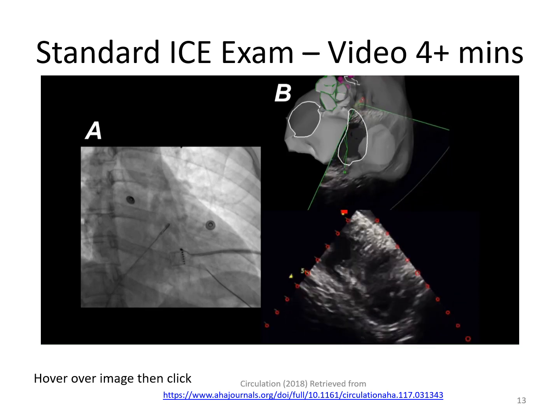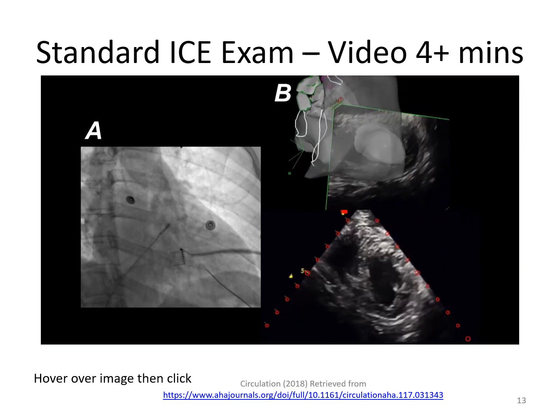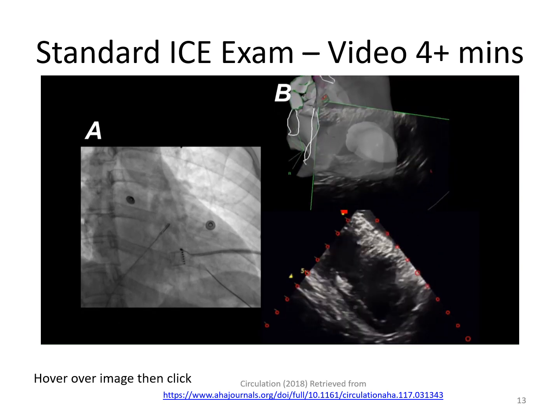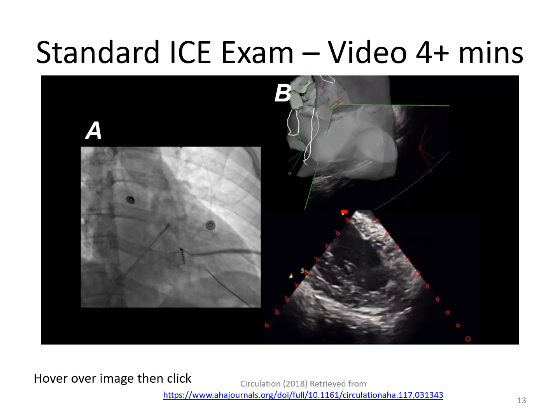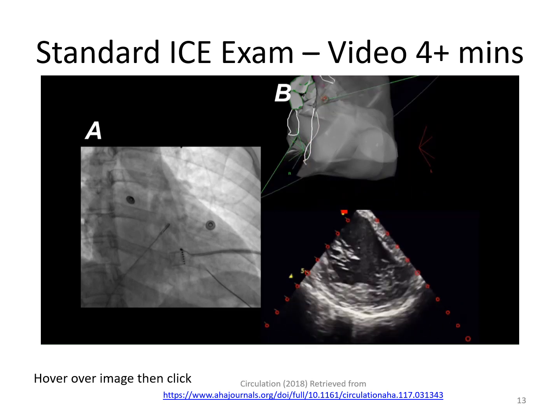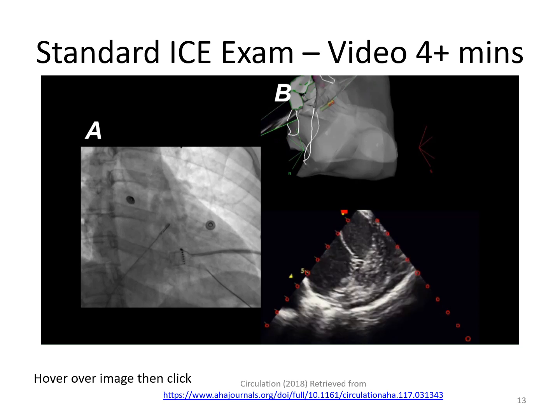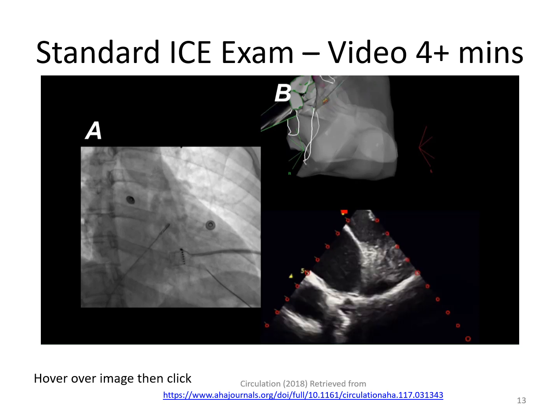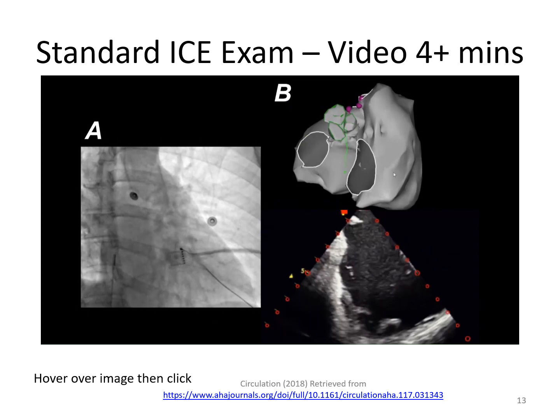tract. From this position, we can rotate the catheter clockwise progressively to image the right and the left ventricles. And as we rotate the catheter, we can image the lateral aspect of the right ventricle, the left ventricle, the left ventricular outflow tract, the coronary cusps.